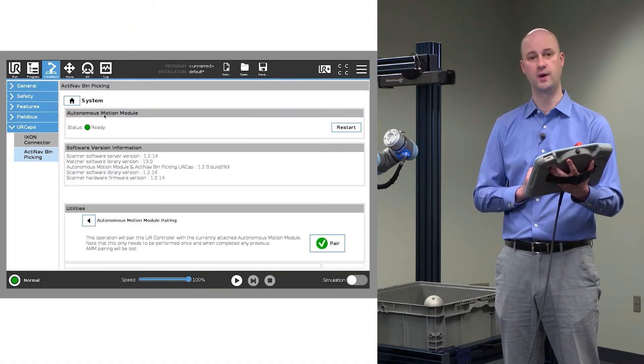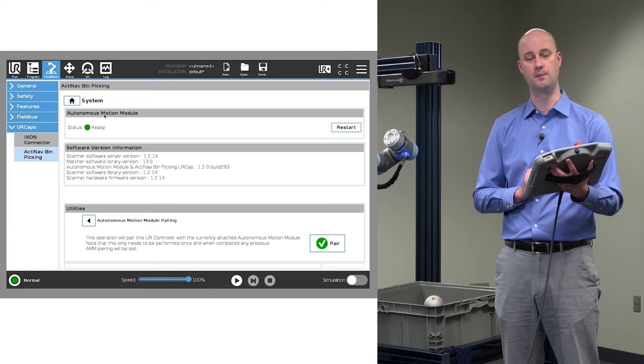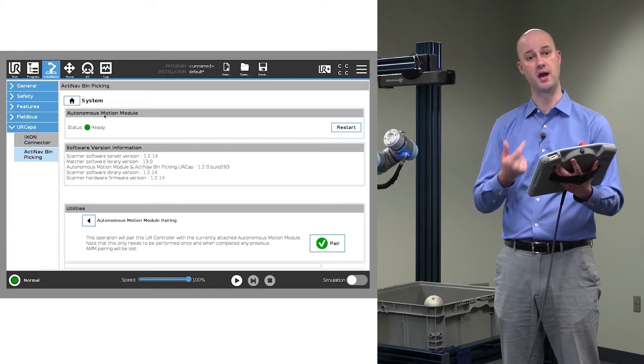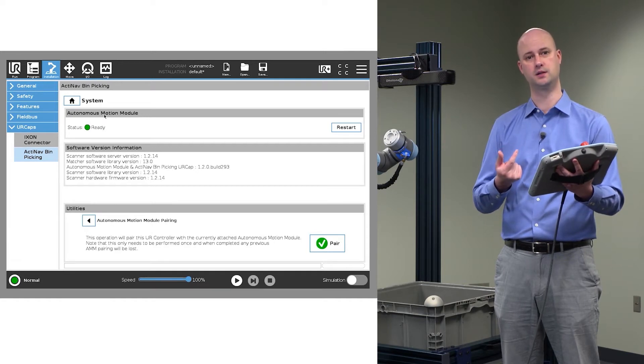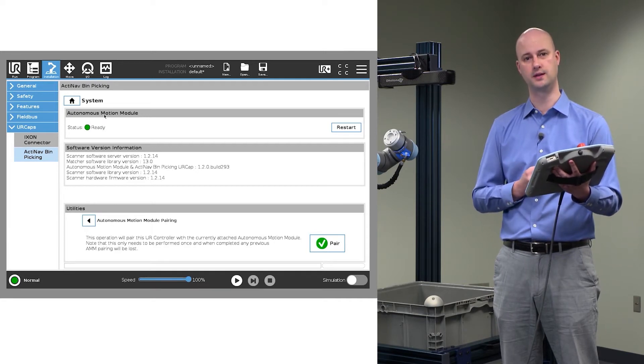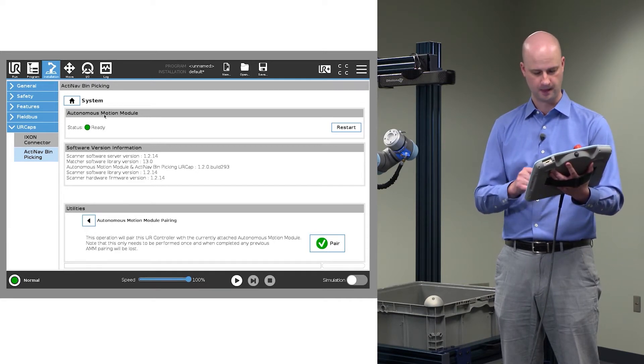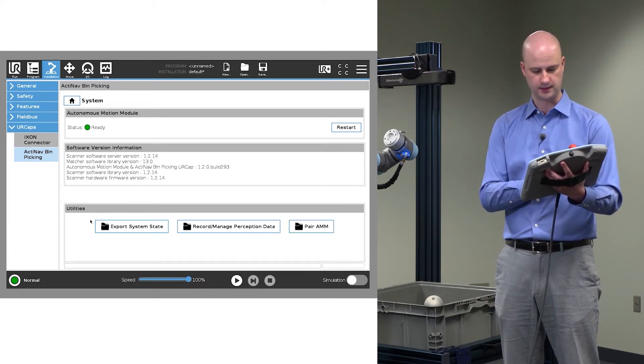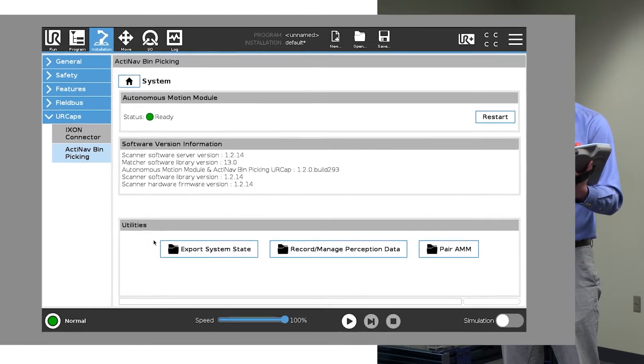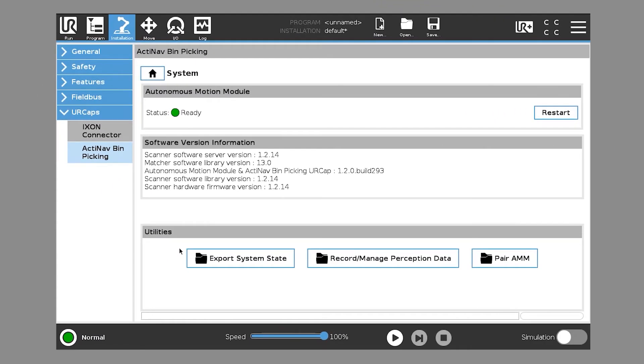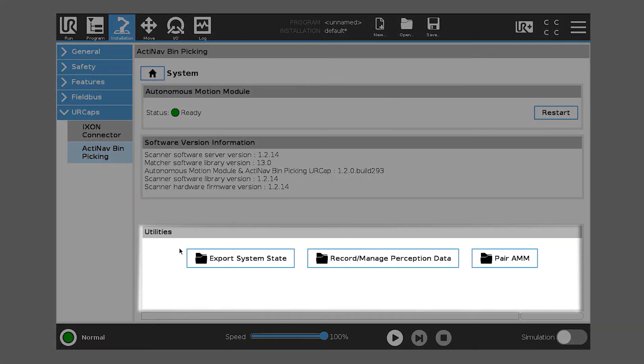The first thing you have to do when connecting them is hit the Pair button to link those two things together. You'll notice down here at the bottom under Utilities there's Export System State, Record Manage Perception Data, and Pair AMM.